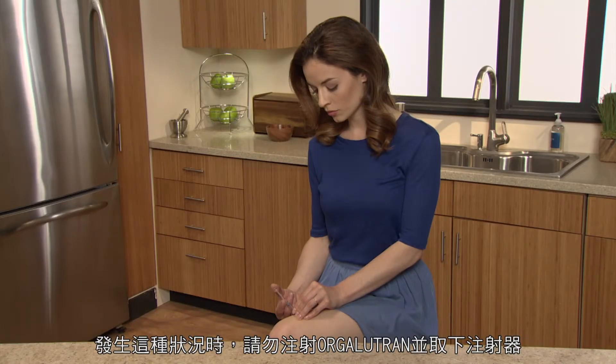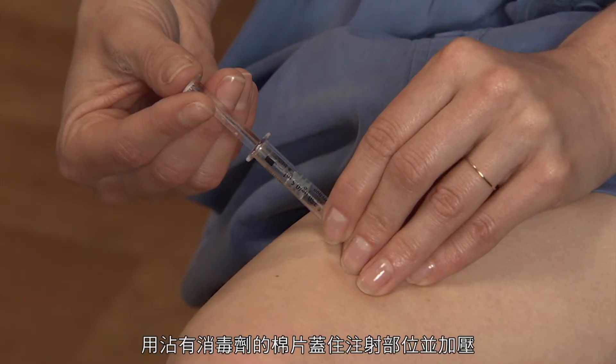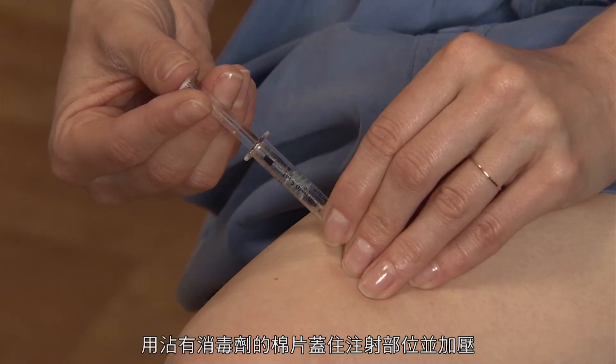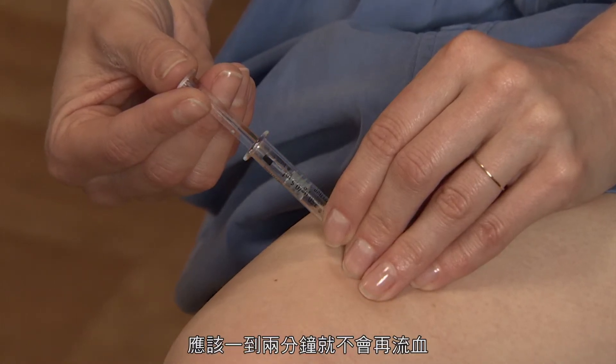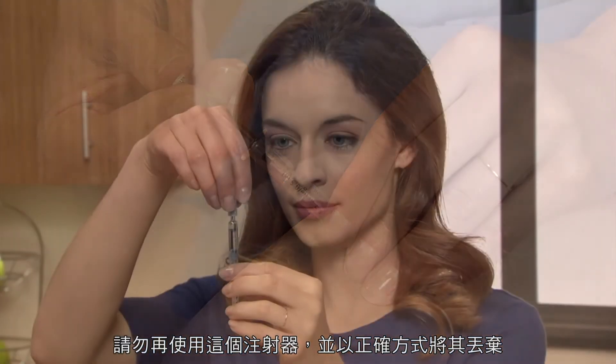If this happens, do not inject Orgolutron, but remove the syringe, cover the injection site with a swab containing disinfectant, and apply pressure. Bleeding should stop in a minute or two. Do not use this syringe and dispose of it properly. Start again with a new syringe.